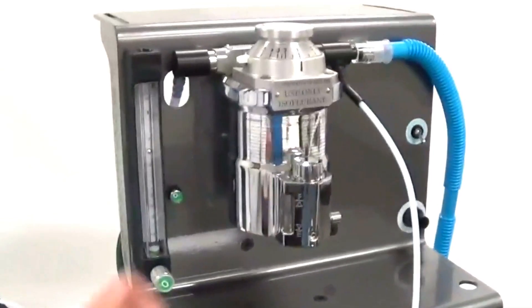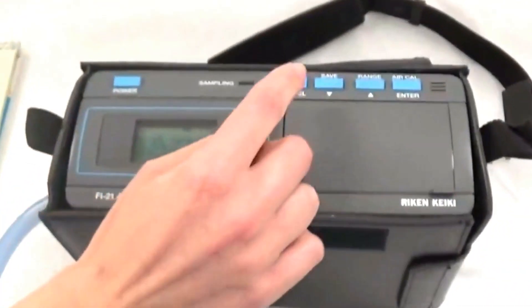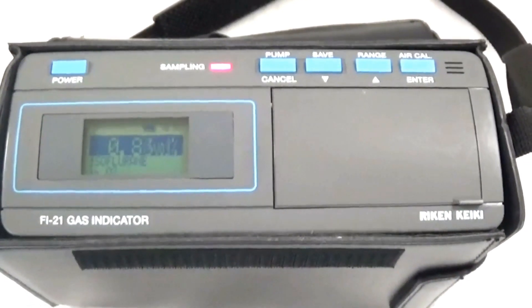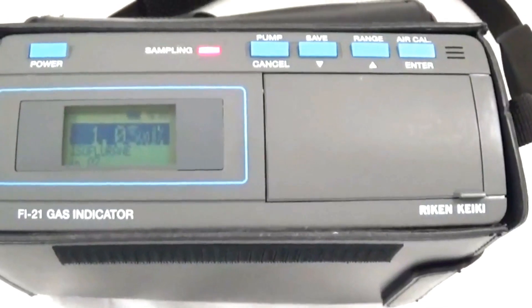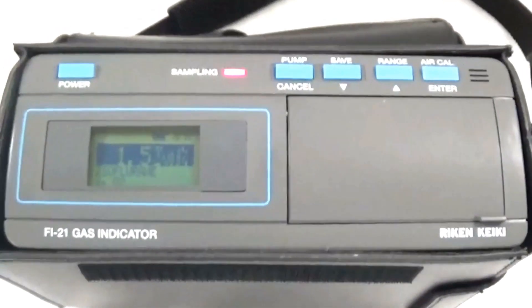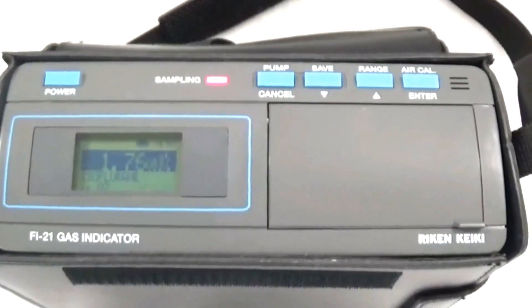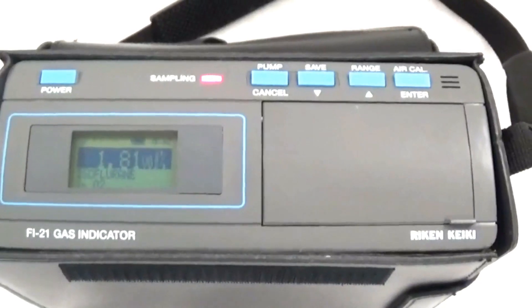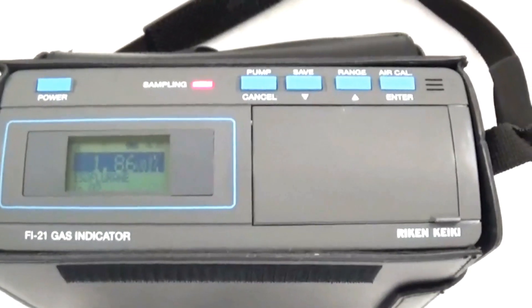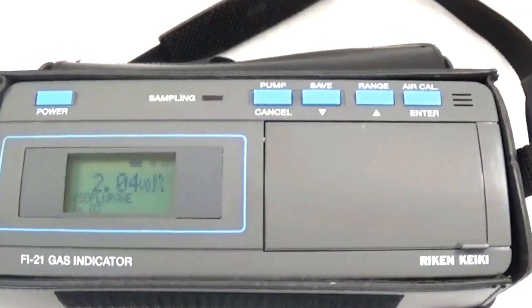We will now advance the vaporizer to 2% and push the pump key. Once again, waiting for the numbers to stabilize. The readings show 1.84, 0.85, 0.86 — we will now push the pump button to turn it off and record at 2.04%.